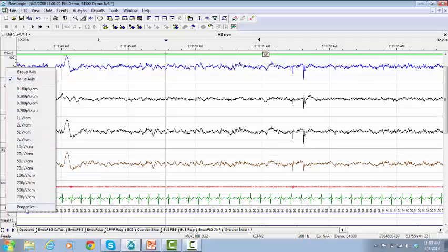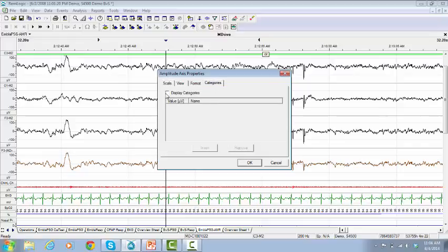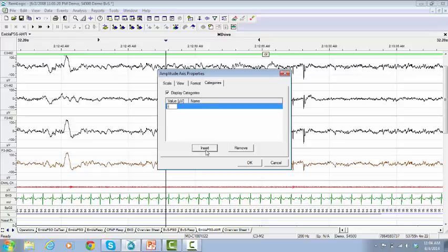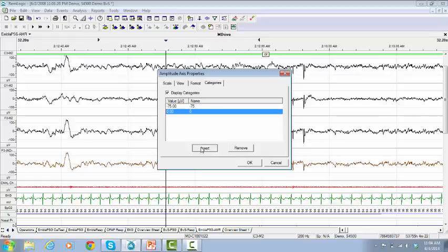Click on Properties. The Amplitude Axis Properties window will pop up. On the tab Categories, check the box to display categories, then click on Insert to insert the values. Click OK.